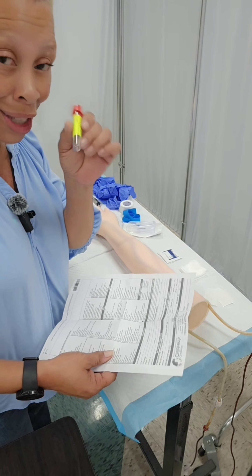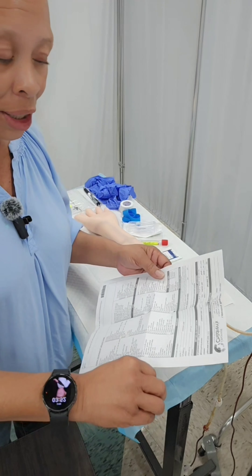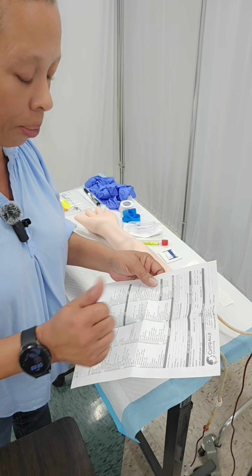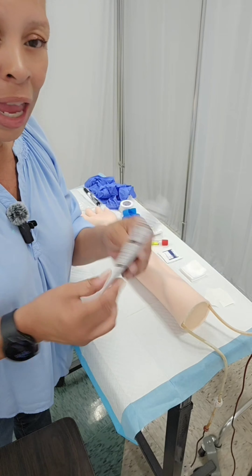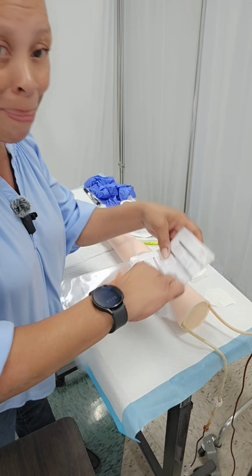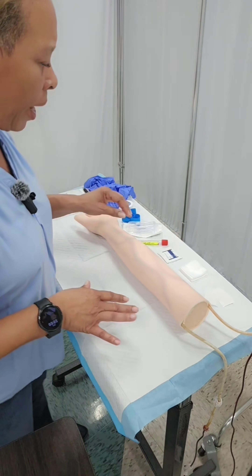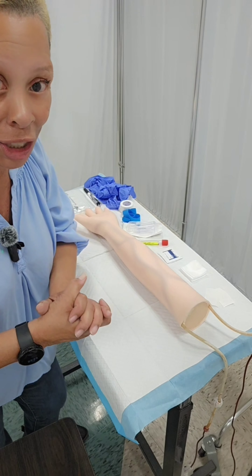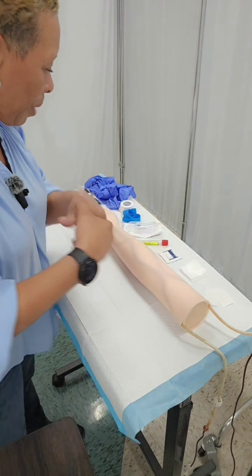Red tops usually will not have any additives in them. Once I've verified my patient's identity, compared it with the lab requisition form or doctor's order, and double checked that I have the correct color tube for the lab I'm to draw, I'm going to fold up the requisition form and place it in the back pocket of the specimen bag so my bag is ready to go. Now I'm going to wash my hands — of course you'll wash your hands once you enter the patient's room. I'm going to use a little hand sanitizer since I've been touching things.